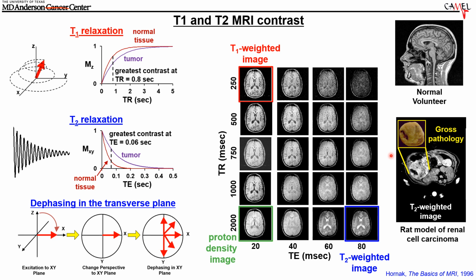This does match anatomically. Here is a rat that was used in a toxicity study, and one of the kidneys became quite large over time. A tumor had started to grow into the kidney. You can see the other kidney over here is normal size. And by looking at ex vivo gross pathology, the rat was humanely sacrificed, and then this tumor was taken out.